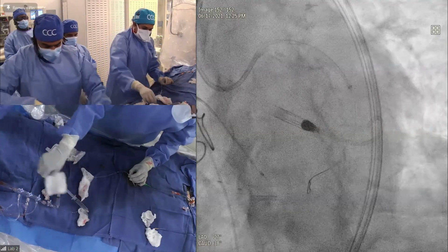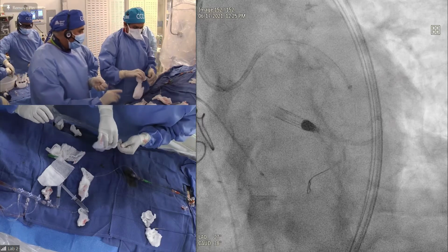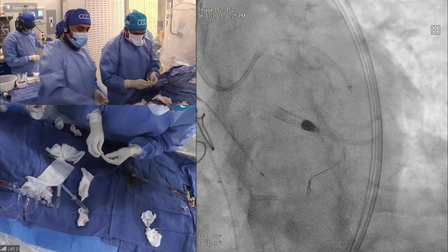Okay. And you see, once you have the Godzilla, make sure everybody could see, very little injection. Yeah, that's a really important point. Everybody sees that the Godzilla is all the way down. You see the tip of it, literally, as I'm showing you.